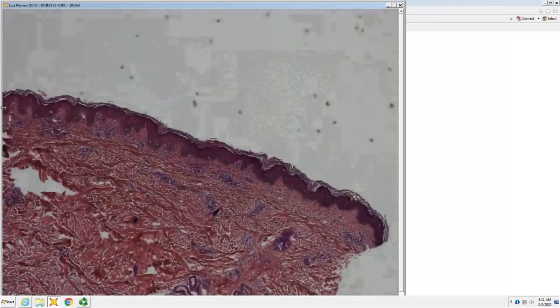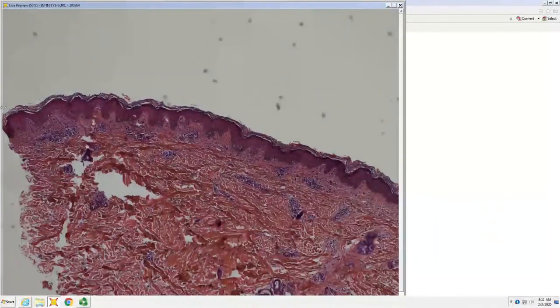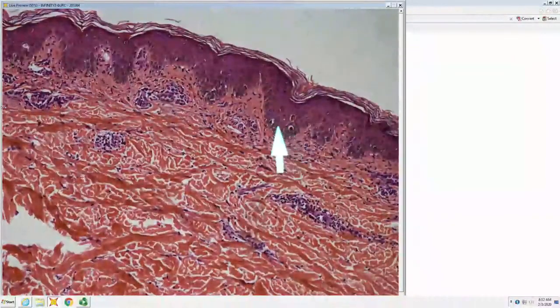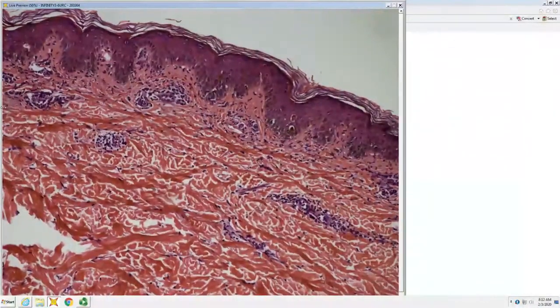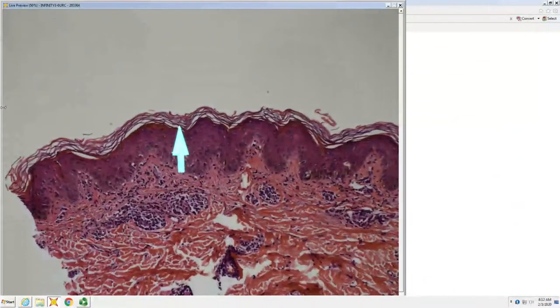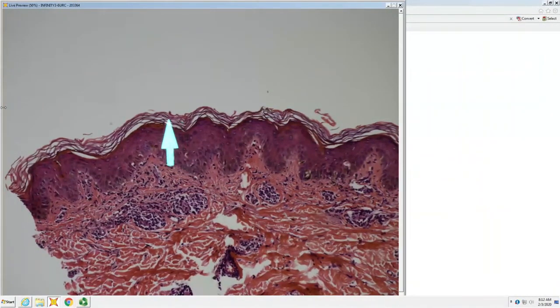Melanocytic proliferation. So it could be melanocytic. We look higher, and it's actually dead reds. So you have an interface dermatitis with necrotic keratinocytes. And looking at your corneum, is this a chronic process, an acute process, or a subacute process? Subacute. Subacute, because you have basket weave on top of compact red.